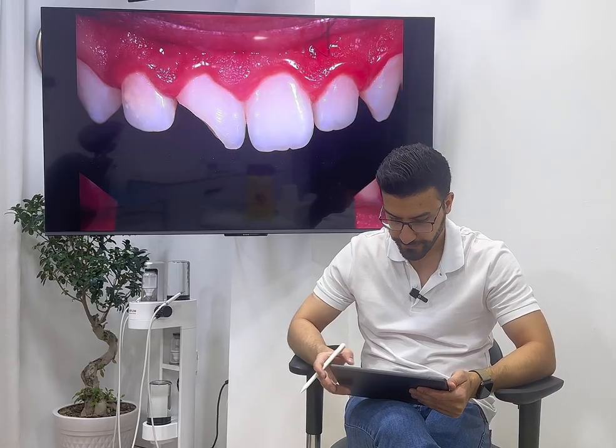So the first thing we are going to talk about is class 4s. How are we going to treat the patient and plan for the treatment, step by step, on how to make the decisions and on how to treat such a case. For example, I have here a class 4.